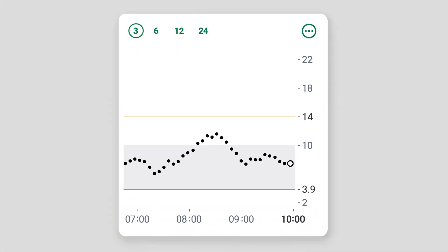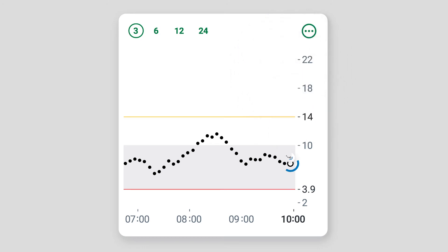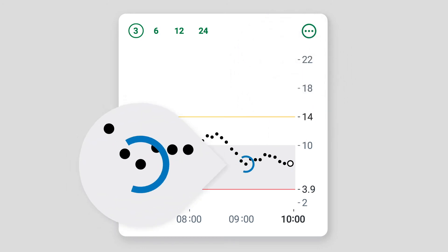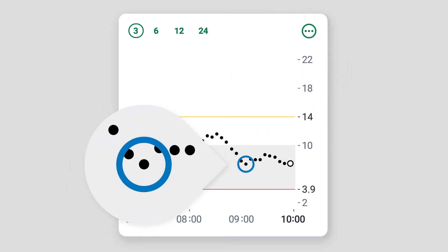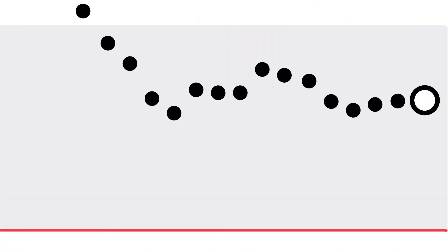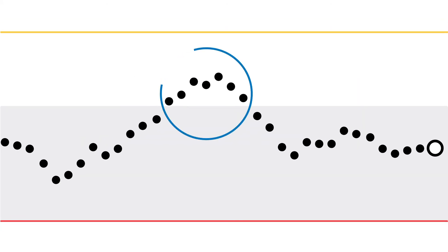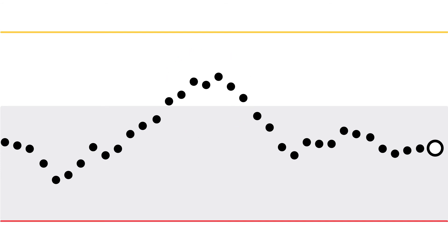The white dot is your current sensor reading. Each black dot is a past sensor reading. The grey section within the graph shows where you want your glucose to be, or your target range. If your trend dots are above or below the grey area, you were or are outside target range at that time.